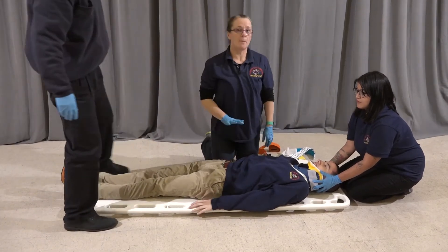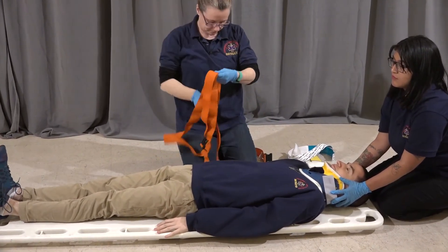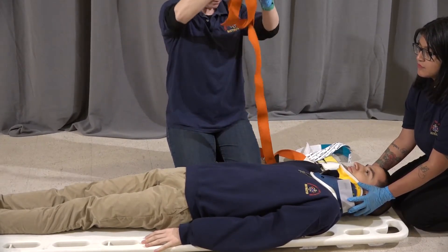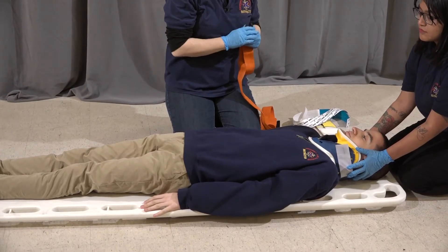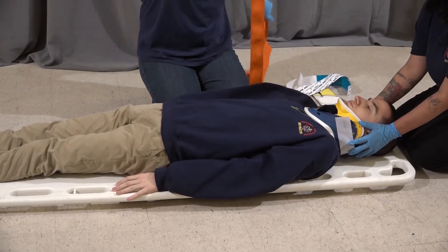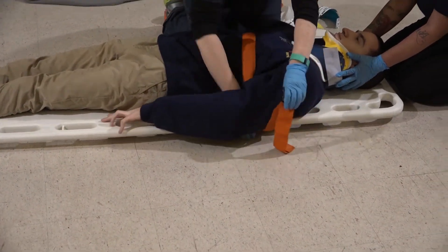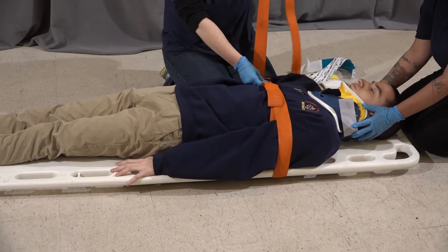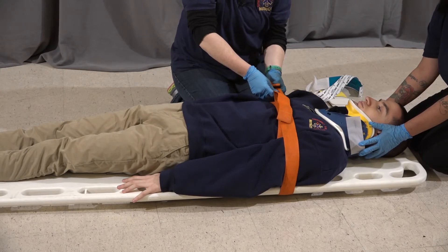If you have control of the head, you're just monitoring — you're not pulling. We're going to start with the chest strap, going under the armpits as high up as possible, under the armpits, over the chest, and crossing over to the side. For the chest strap, you want to make sure you're off center in the event that you have to provide emergency care such as CPR.